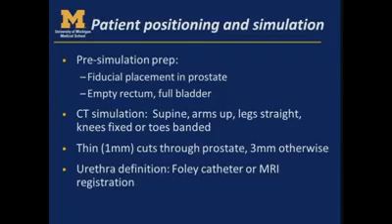For patient positioning and simulation, it's very important to do a pre-simulation prep, just as patients have done for fractionated therapy as well, but even more important for SBRT because it's fewer fractions, you have less room for error. Typically we have fiducials placed in the prostate, whether they're just standard markers or tracking markers. The empty rectum is very important because we want to have a very consistent prostate position relative to the rectum as well, a full bladder to get the bowel out of the way.